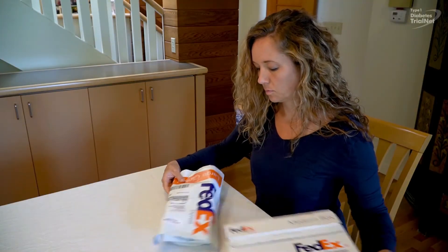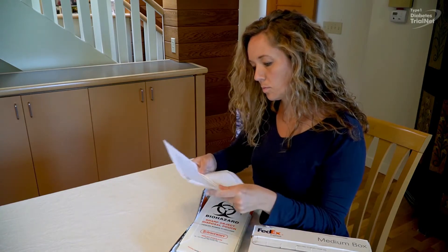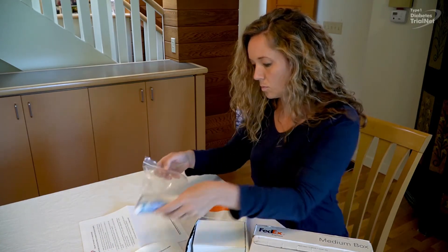Thank you for participating in the TrialNet Pathway to Prevention study. This test kit has everything you need to collect a blood sample at home using a finger stick. Before starting, please watch this video from start to finish.